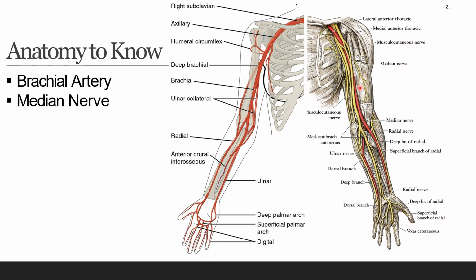But again, just to summarize, we don't want to stick arteries or nerves. Look for that honeycombing structure more distally in the nerves, thick echogenic walls, pulsatile flow, and whether things compress.